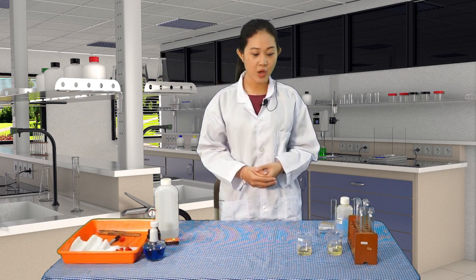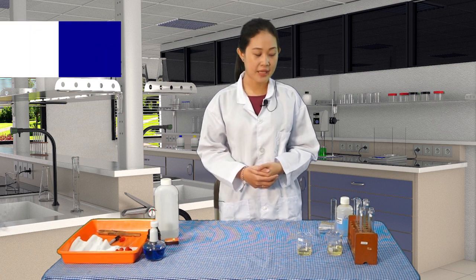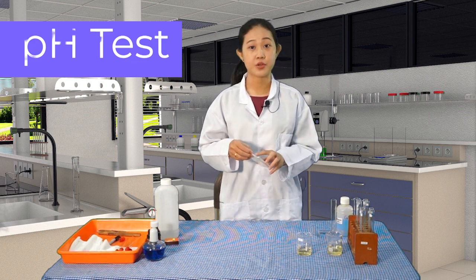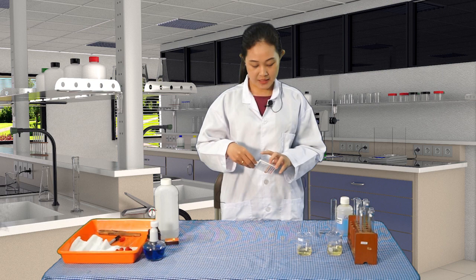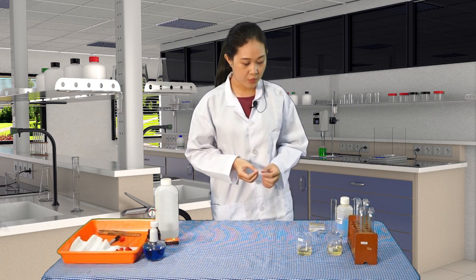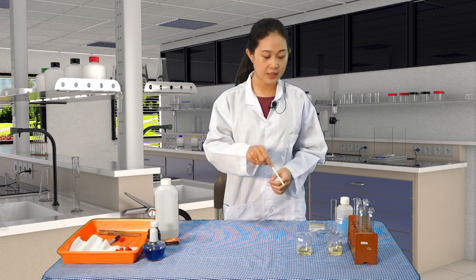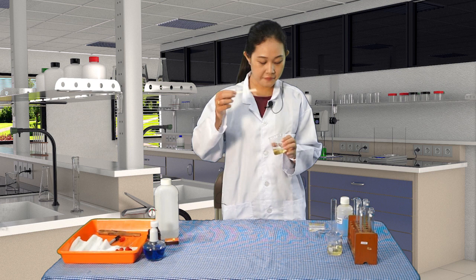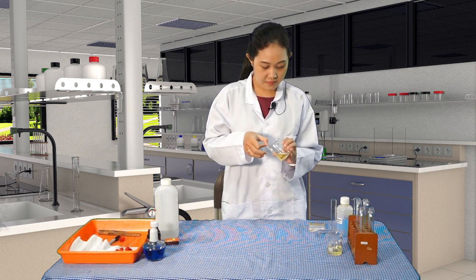Okay, students, now we are going to continue with the other physical property test, which is the pH test. So here I have the pH paper and the indicator that we are going to use. Take the pH paper out, and then we can just directly dip it into the urine sample. So this is the X1, so just dip it enough like this.